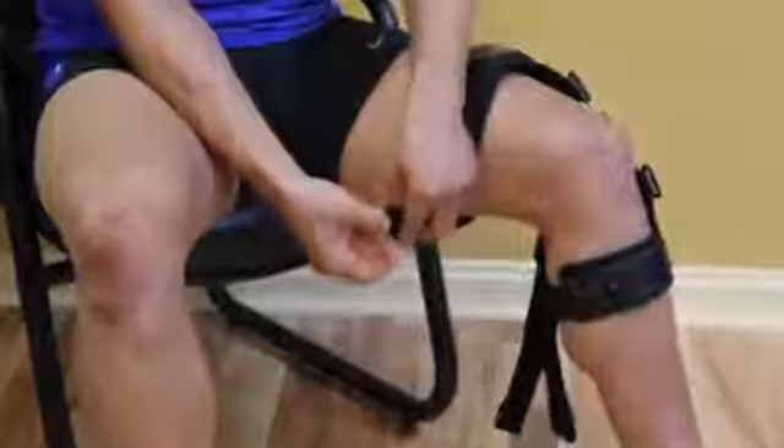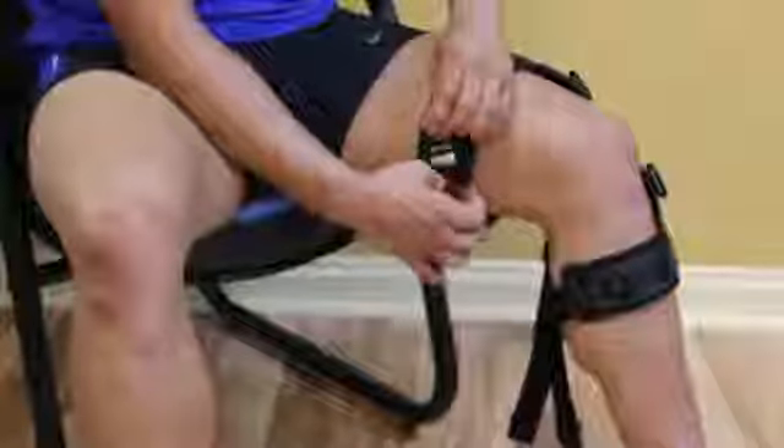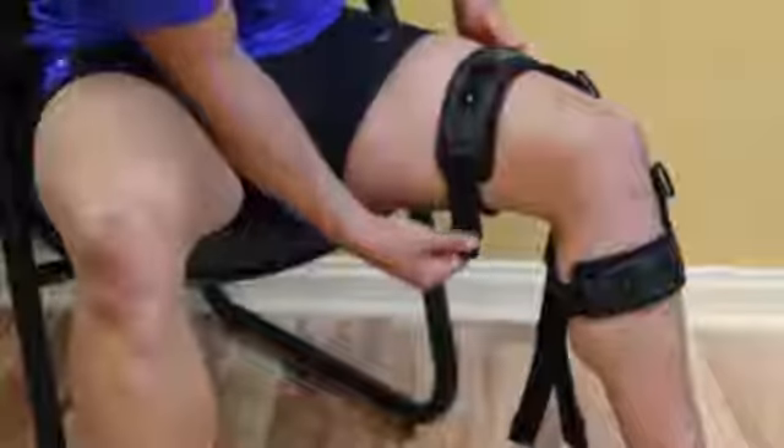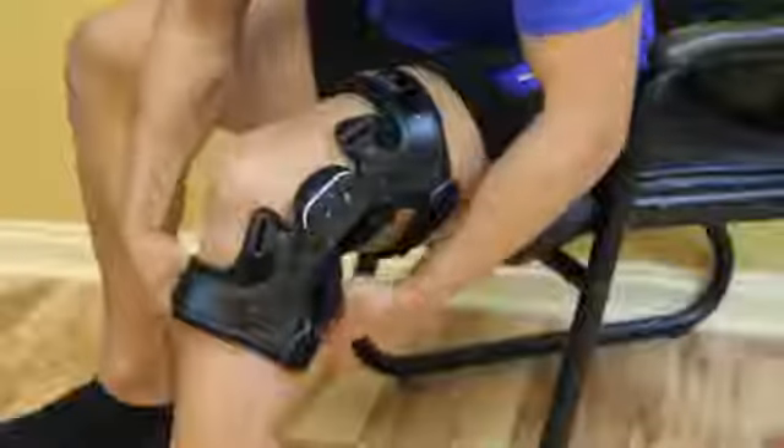First, fasten the lowest strap on the brace and then fasten the highest strap, which wraps around the back of the patient's calf. Then fasten the second lowest strap on the brace.